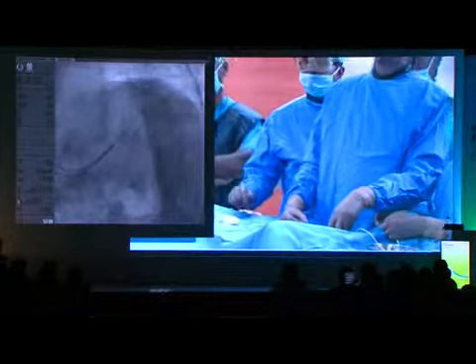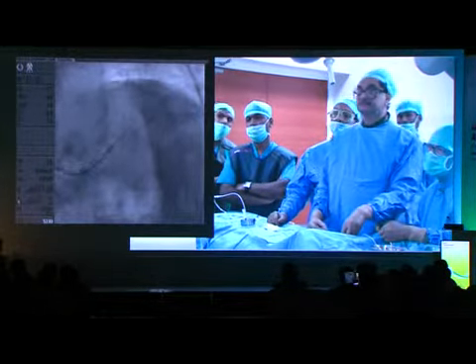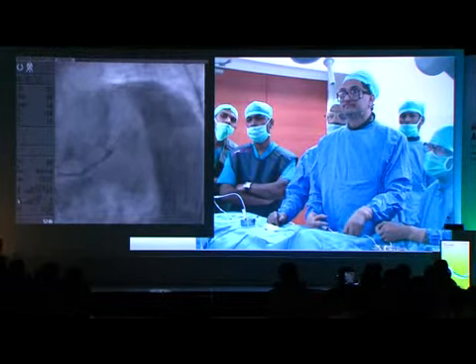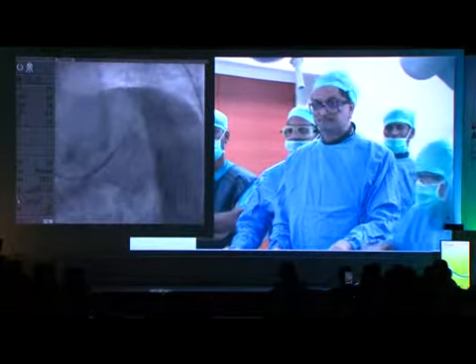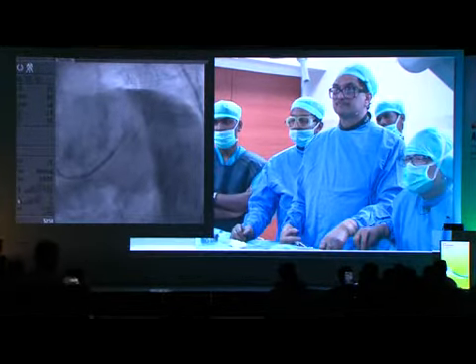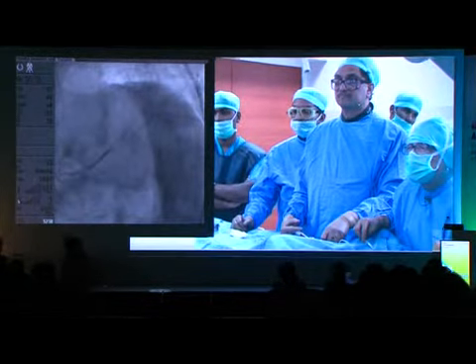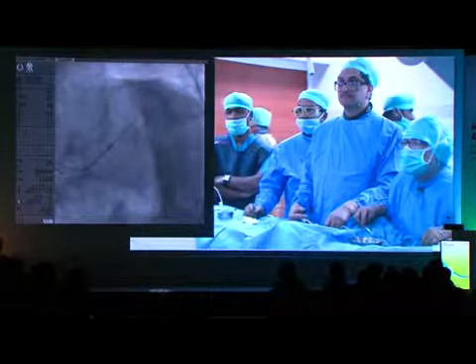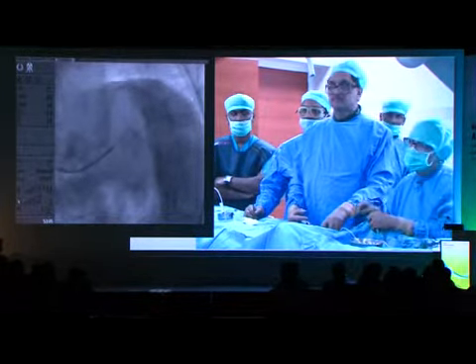Can you hear me? Yeah. You see the angle. That's why the force is not being transmitted. Can we take a little bit harder tip wire? With the angle you are having, that 90 degree angle, hopefully it's not going to cross. So my advice will be to take a little bit harder wire. You see this buckling? The moment you push, it will come out.